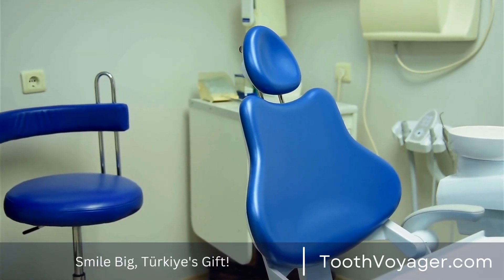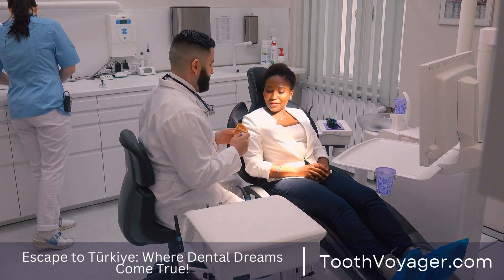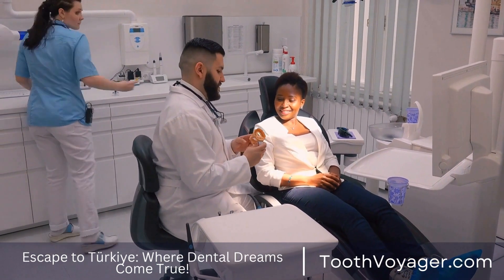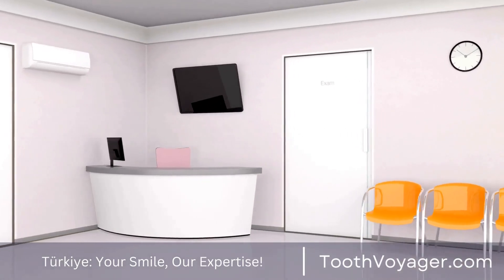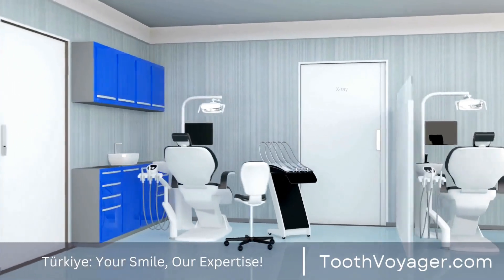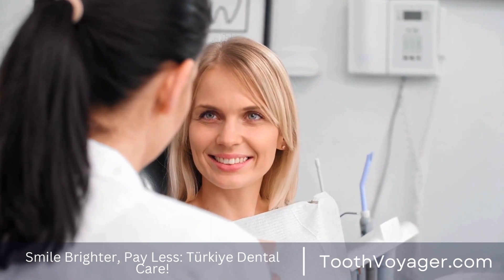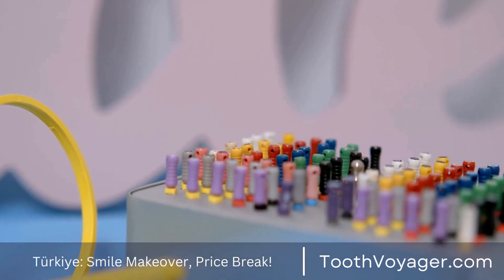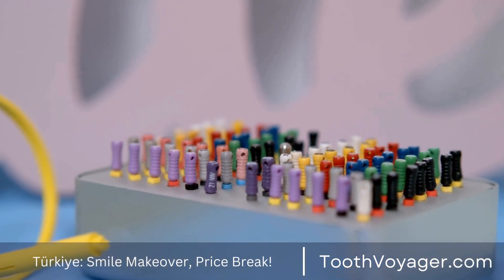The incision is sealed with stitches. Patients will need to wait a few months for the bone graft to grow and become integrated with bone tissue before the dental implant is installed. When the bone graft has fully healed, the dentist can place the dental implant inside the jawbone. It will function as a substitute tooth root, giving security and support to the dental prosthesis. When properly cared for and maintained, dental implants will endure for years and help restore appearance and function to the smile.